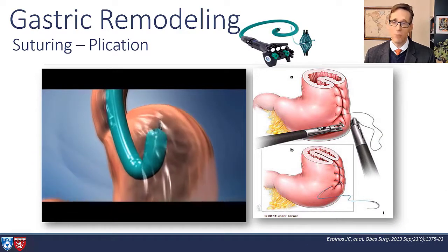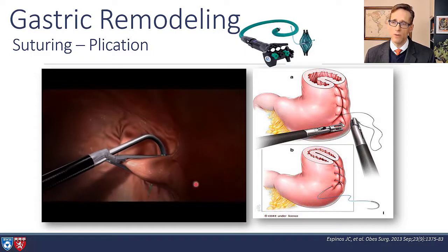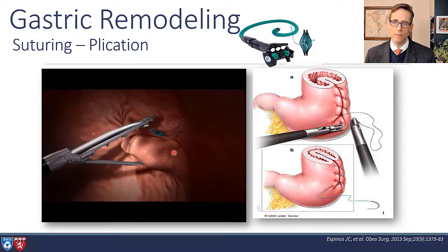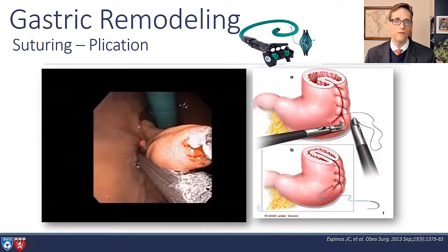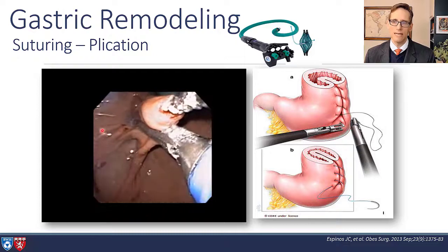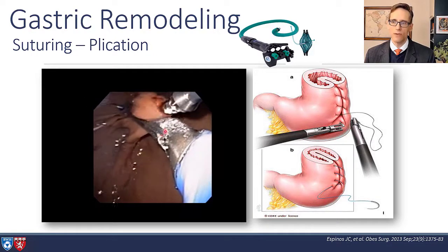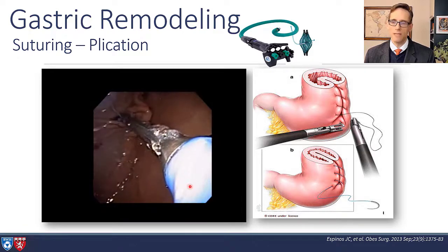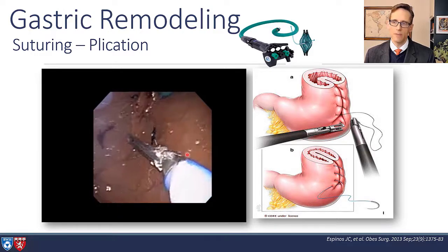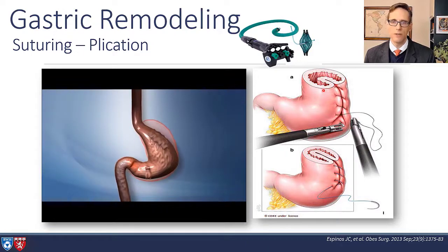Moving on to gastric plication. And this is different than suturing. So instead of mucosa to mucosa, we're plicating serosa to serosa on the backside of the stomach. So we grab tissue with a full thickness tissue grasper. A hollow needle passes through that tissue and deposits a tissue anchor distally here. And the needle is withdrawn. The device is opened and another tissue anchor is deployed on the more proximal side here and secure. So you see this is truly serosa to serosa along the greater curve.